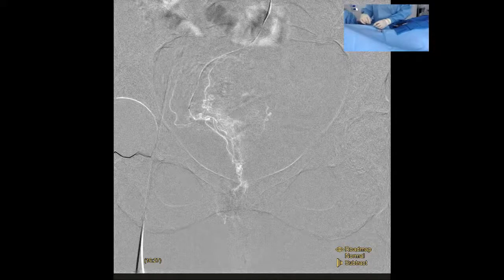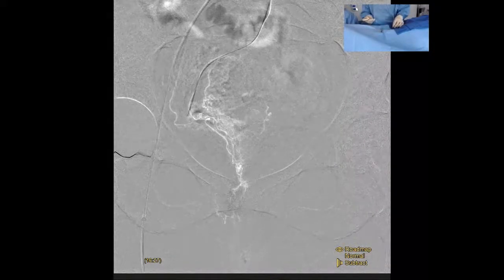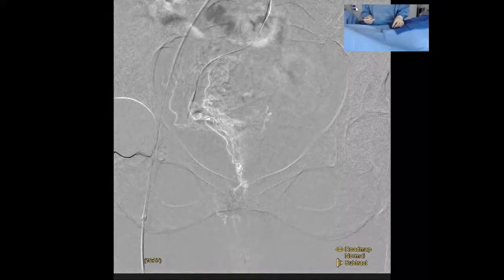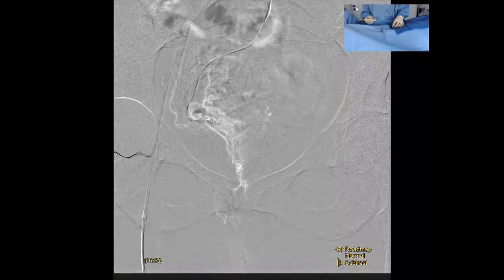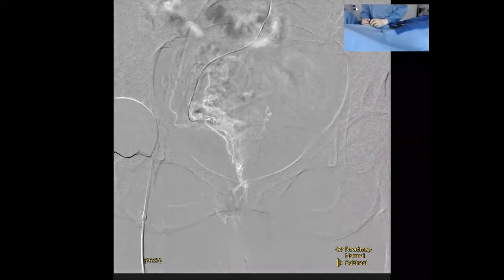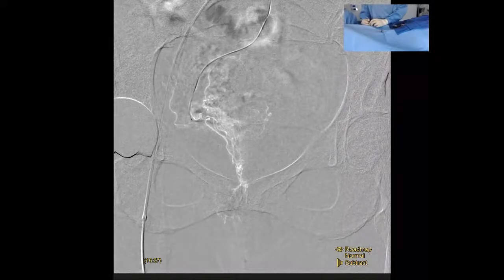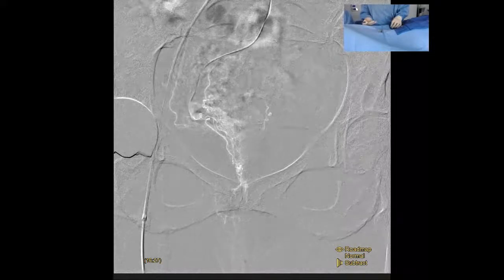And in the most recent randomized controlled comparative study that looked at different size embolics, it looks like no matter what, it's still favoring going towards that mucosal vessel. So what happens here if you just push the catheter? Will it go on? Yeah, so you can try that here and see.